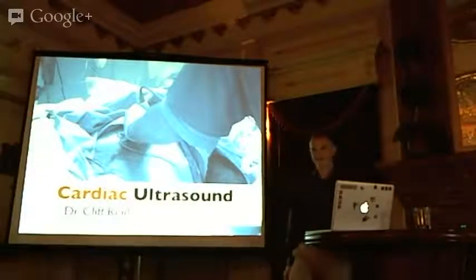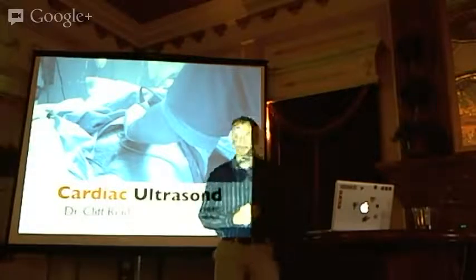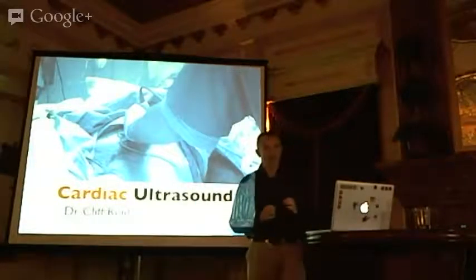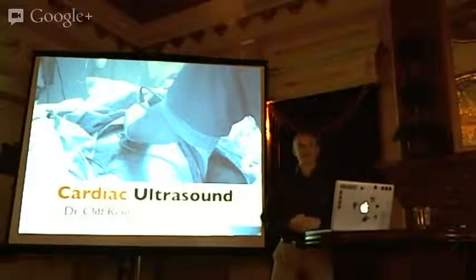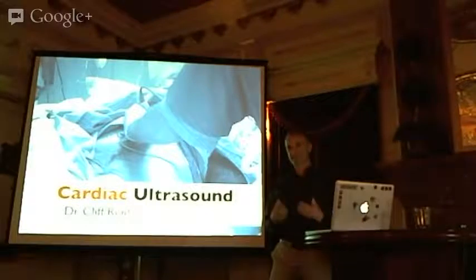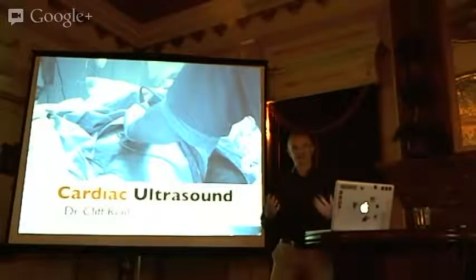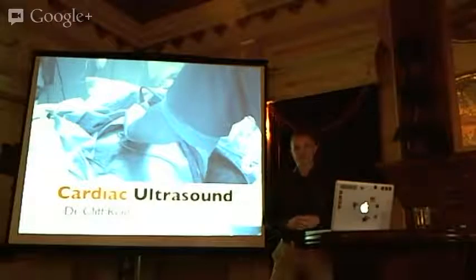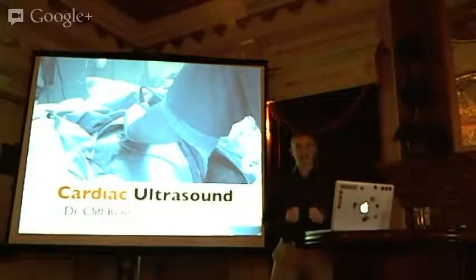Okay, we did trauma scanning this morning, which is nice and important, but how often do you really have a patient in whom you're worried whether they need to go to the operating room right now because they might be bleeding to death in there? Pretty rare, isn't it? A lot of emergency medicine ultrasound started for many of us with FAST scanning, but if you look at some of the other modalities we employ, some of them are much more frequently required.